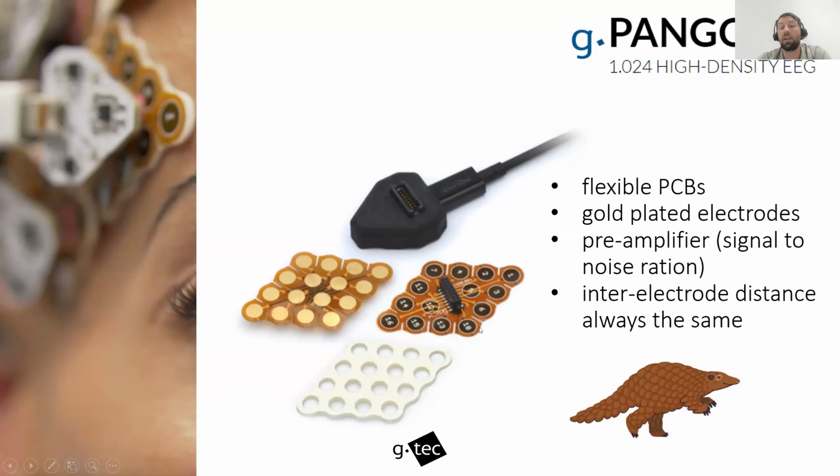And if you use more grids aligned next to each other, you always have the same inter-electrode distance. So if you attach grid by grid, you keep the same distance and you can extend the amount of channels that you want to use depending on your experiment and setup.